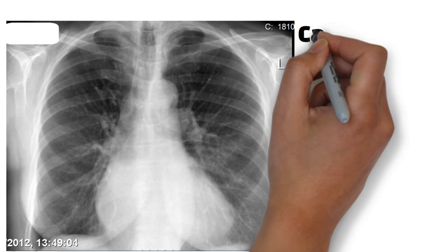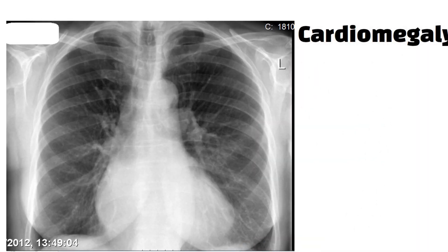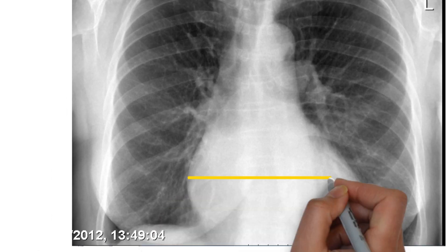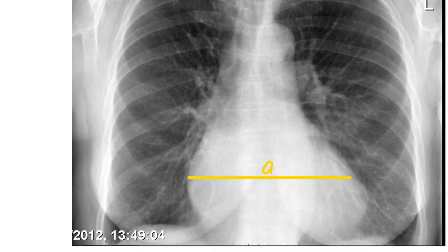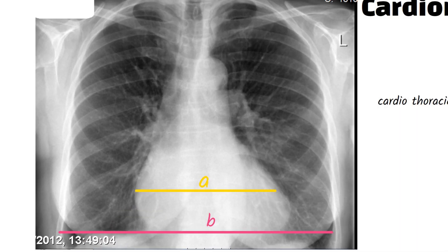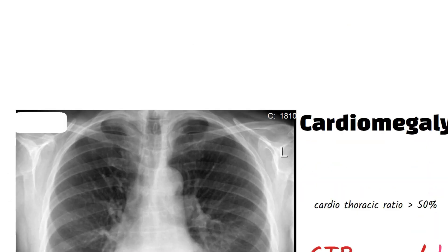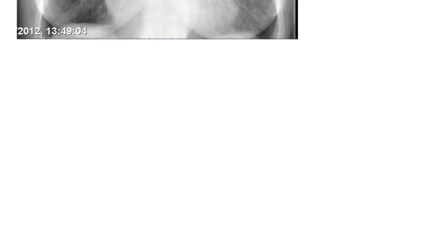C stands for cardiomegaly. If the heart is enlarged, the cardiothoracic ratio will be more than 50 percent, and the cardiac silhouette will be enlarged.